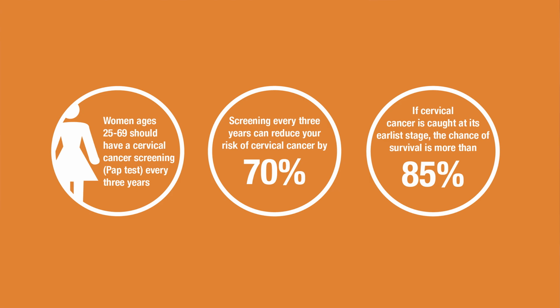The colposcopy procedure will indicate whether the pap test only looks abnormal due to a lack of estrogen or because the pap test is abnormal.